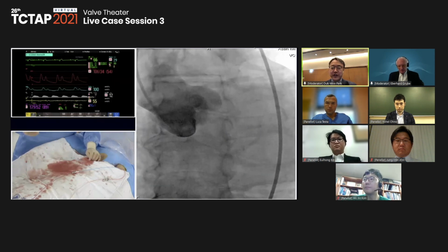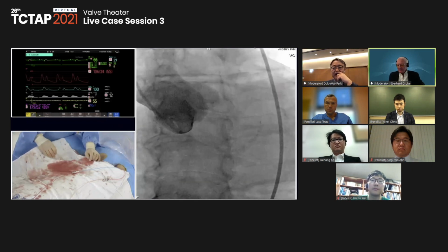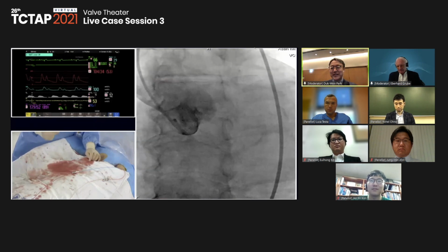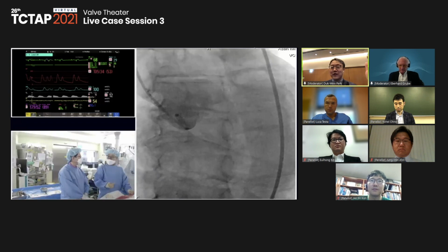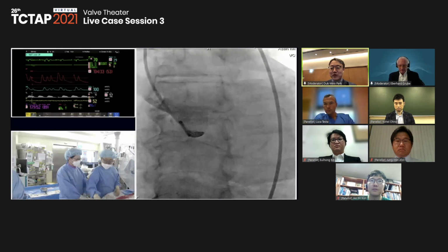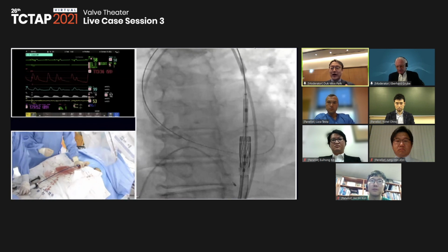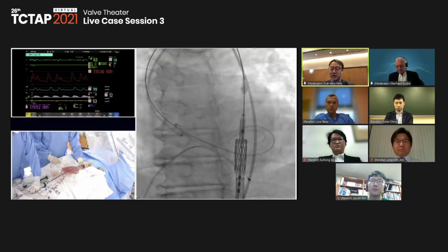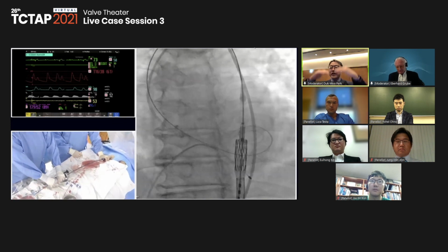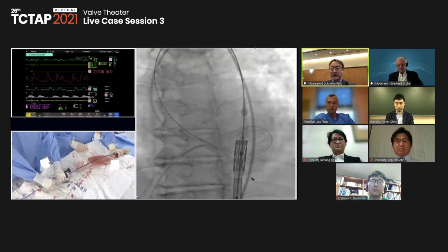we frequently do pre-dilation. So why did you take 500? Yeah, it was an empirical threshold. Sometimes even at 700 we do it without dilation, but it's on our empirical basis. Less than 500, we don't feel much resistance, but more than 500, we sometimes feel resistance passing the valve through the calcified aortic valve.